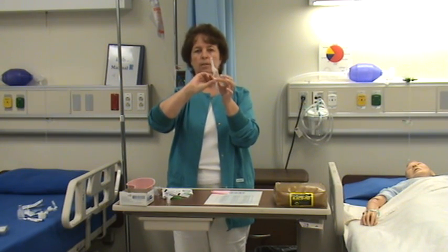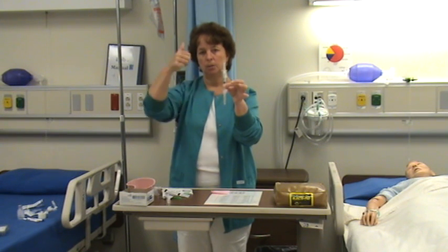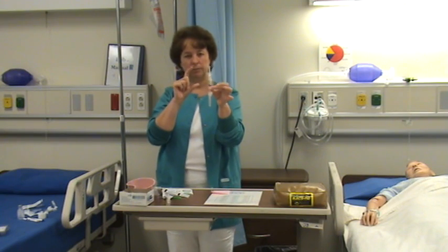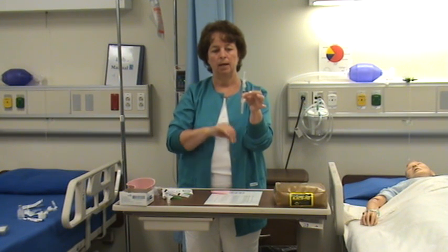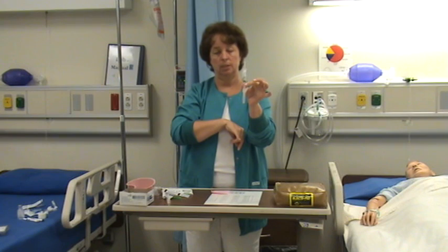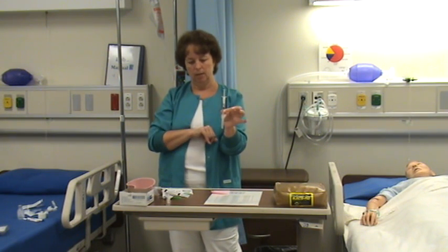So when I turn the syringe upside down, that air is at the top. When I inject the fluid, the fluid will be followed by air, so no medication is left in the subcutaneous tissue — it will all be pushed down into the muscle. You'll often see this used with Lovenox or heparin, anticoagulants that can damage tissue. So I've got my airlock in there.